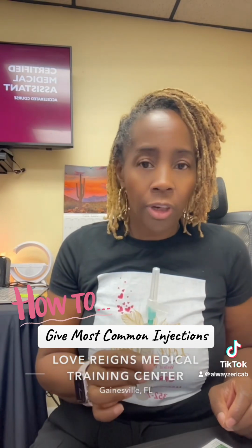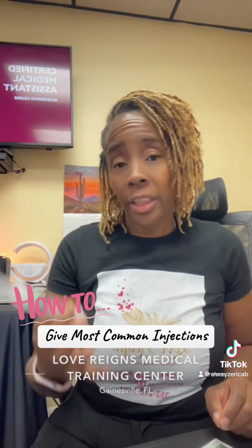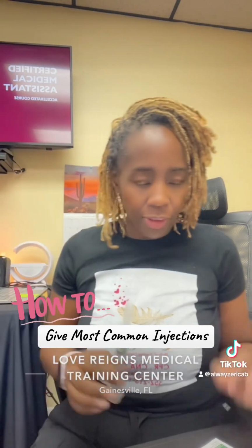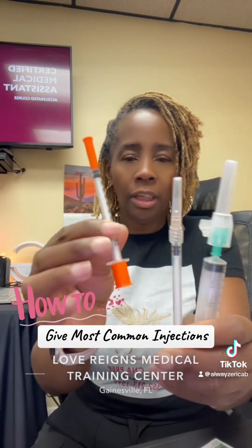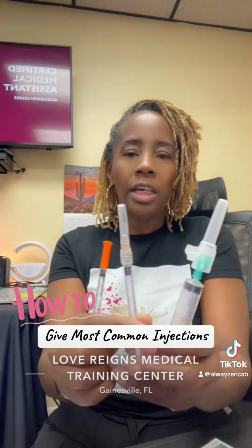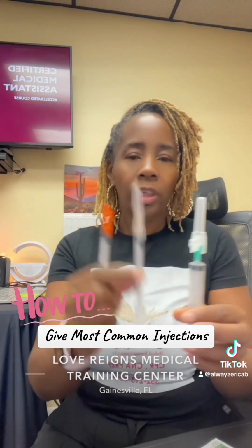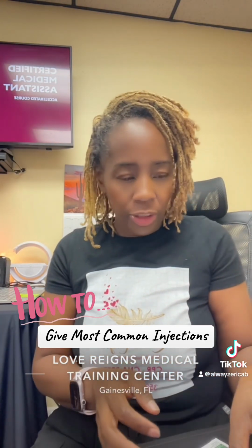A lot of people sleep on the gluteal injection because to me it's less painful, but people are scared of getting a shot in their butt, so you never know why they don't want to take it. So these are the three most common injections: the insulin needle, which is subcutaneous, intradermal, and then this is intramuscular. Sub-Q, intradermal, IM. Those are the three injections.